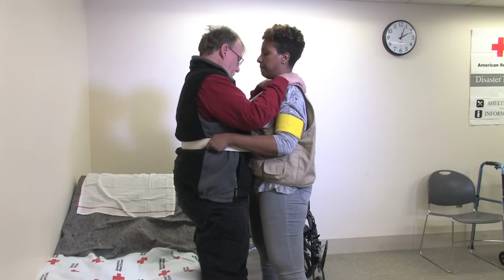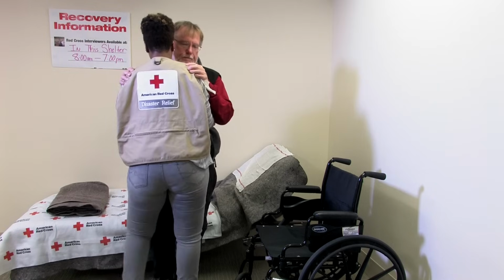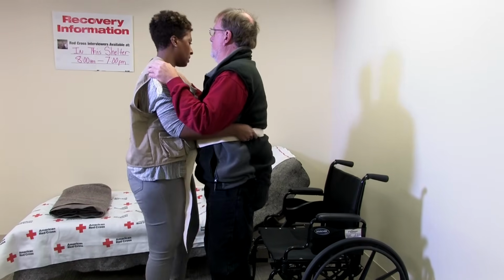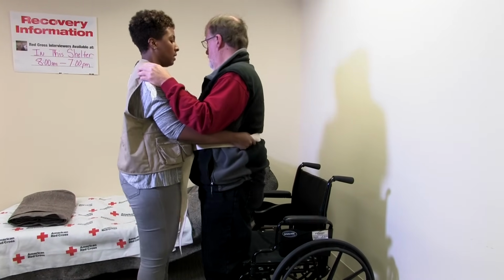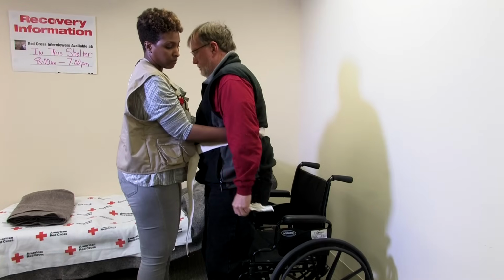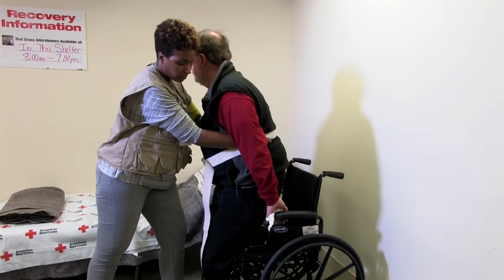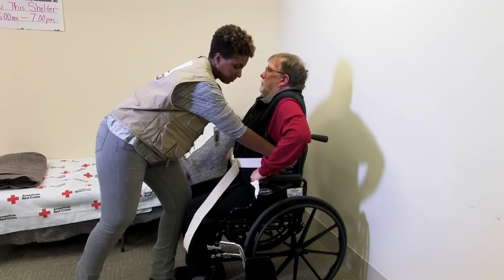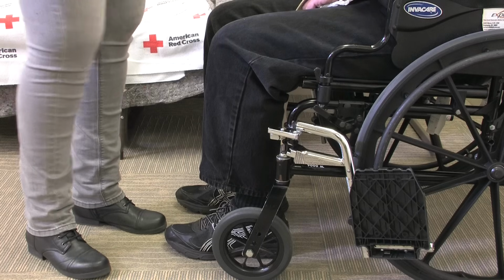How's that? You doing okay? Yep. Okay. I'm good. Now we're going to swivel around towards the wheelchair, okay? Okay. And let me know when you feel the backs of your knees hit the back of the wheelchair. Okay, I'm there. And then I want you to take your hands and feel for the arms of the wheelchair. Okay. And then I want you to gently ease down. Okay? Yep, I'm good.